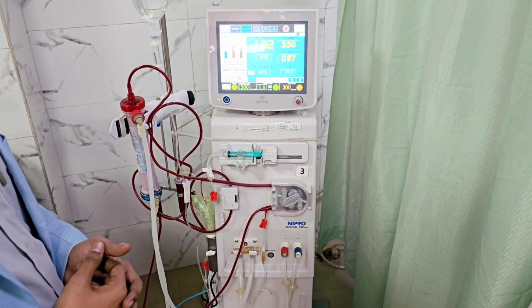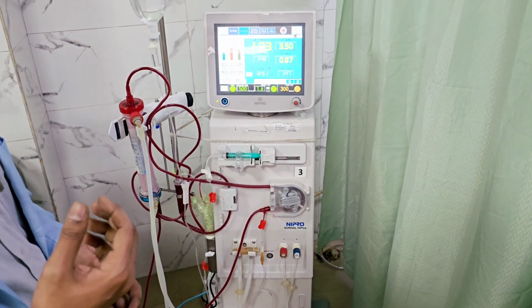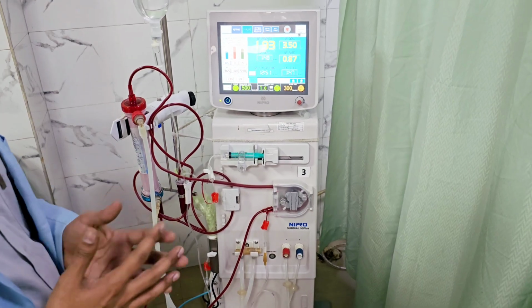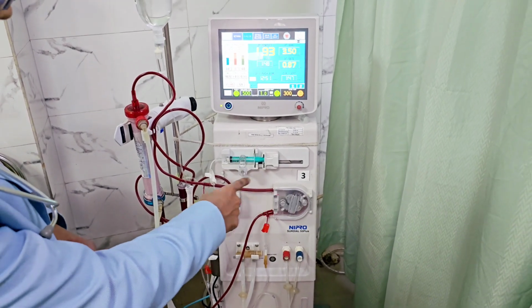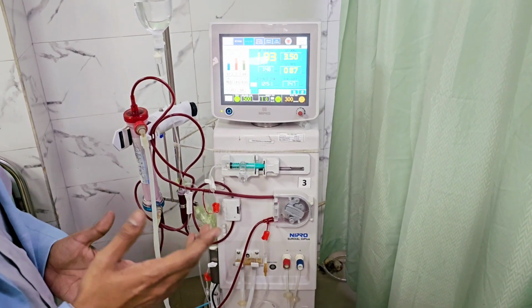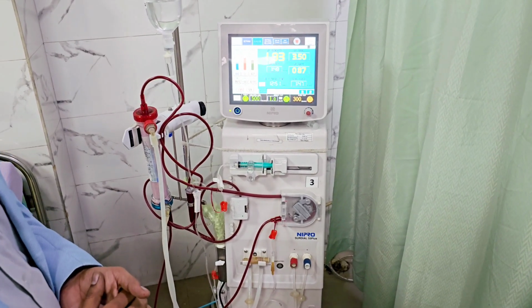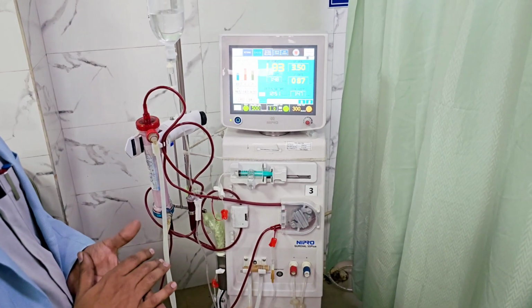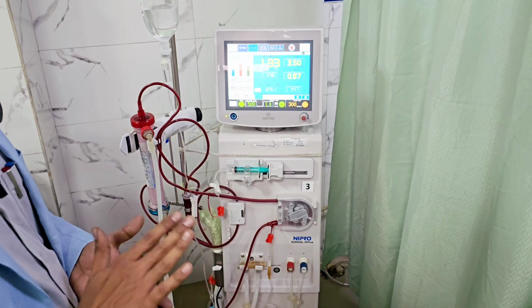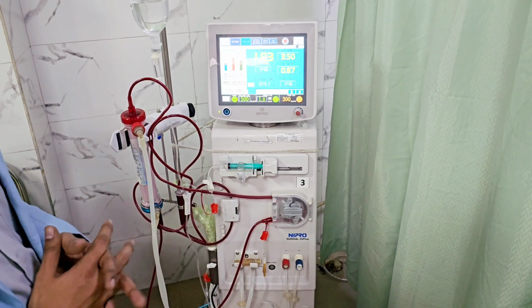In patients with cerebrovascular accident with intracranial bleed, anticoagulant should not be given. But the problem in not giving anticoagulation is, this is the external circuit in the dialysis, and the blood will get clotted. During that time, there is one modality of dialysis called heparin-free dialysis. In that, we won't give any heparin. Then why is the blood not getting clotted?